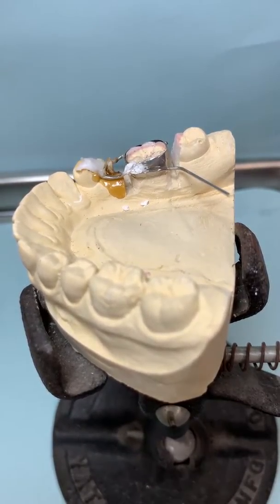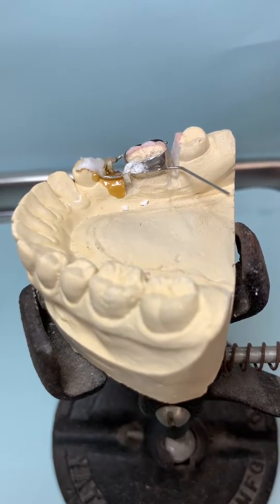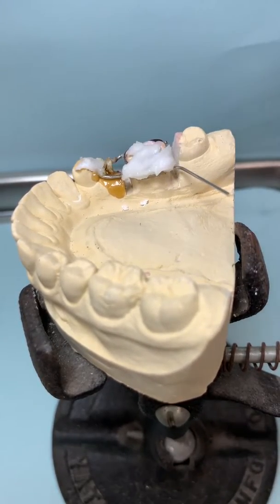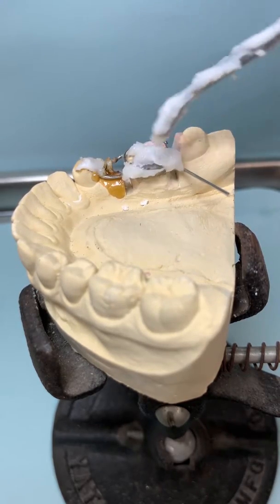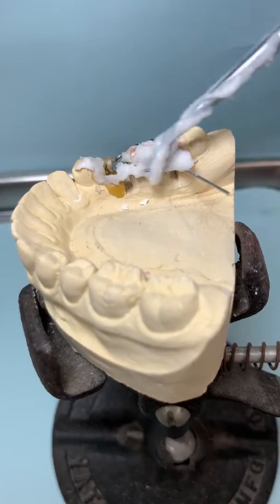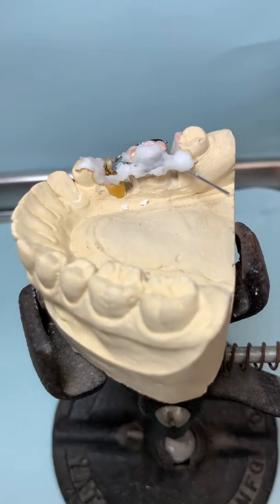We have our wire set in place. We want a little fluoride flux — place it on the area. This will prevent oxides. We have our silver solder ready.